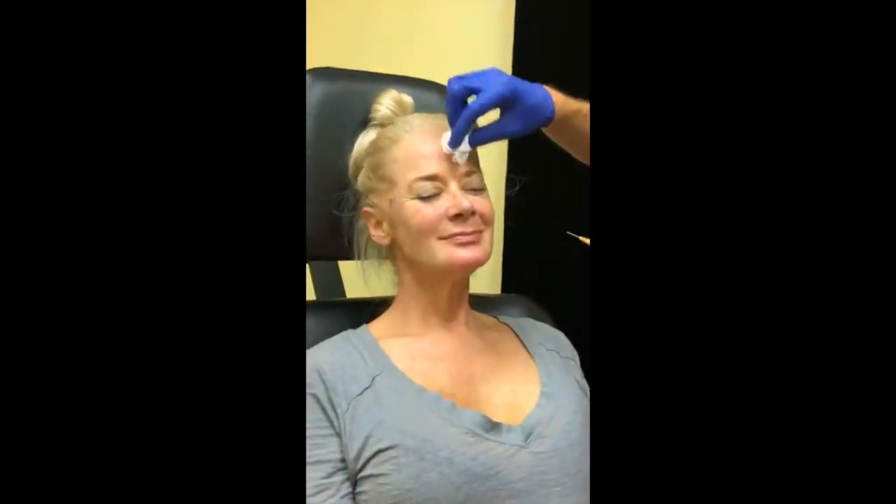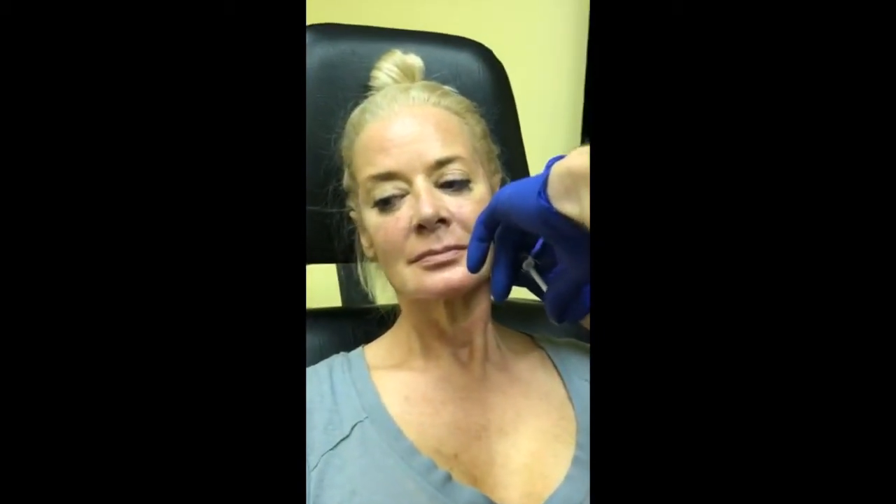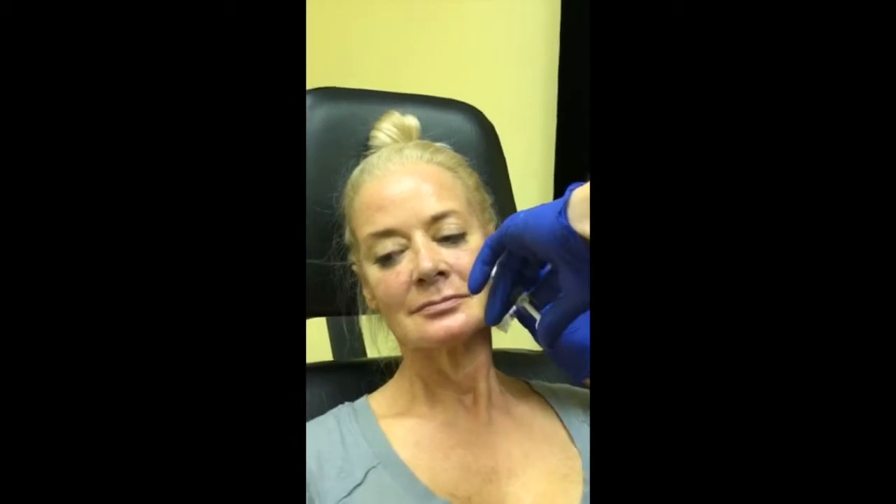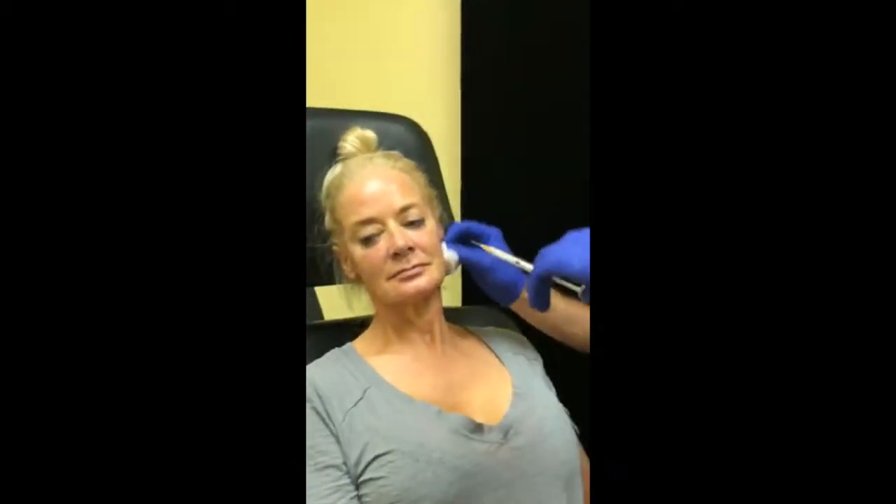Can you use it under the eyebrows? You can use it in that whole area too — almost anywhere in the face really. So we've gotten that done; let's move on and soften this shadow underneath the cheekbone. We did a nerve block before we got started, which gets the central face numb. And Belafill has lidocaine in it, so as we start injecting the area gets more and more numb — the first injection in an area stings the most and then it kind of goes away.